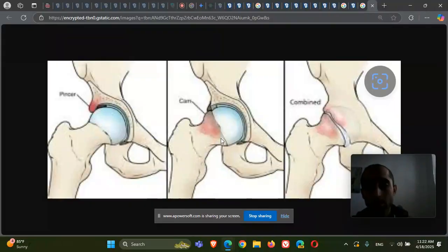It not must. People can have those variants and be asymptomatic and normal. Those can be seen on radiographs, in symptomatic patients, and when the patient is symptomatic with complications, it's called femoroacetabular impingement with its complications.